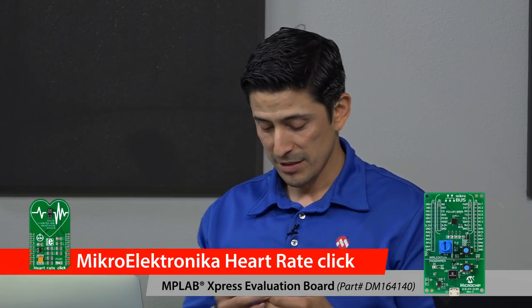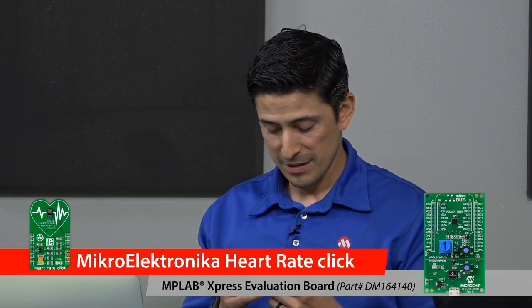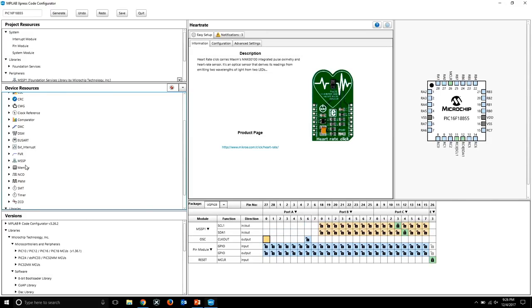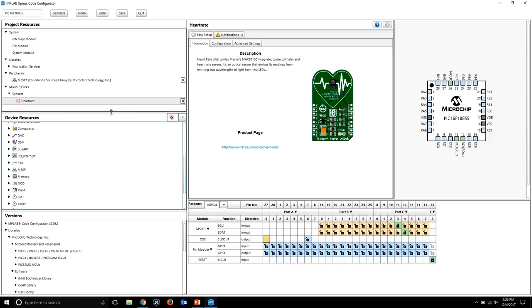All right, so I'm going to go back to the MCC. From MCC, you can see under Mikroelektronika Clicks there is Sensors, and under Sensors we have a Heart Rate sensor. I'm just going to double click on the heart rate sensor, and you can see it gets added to the project. It matches, so double check to make sure you have the right click.